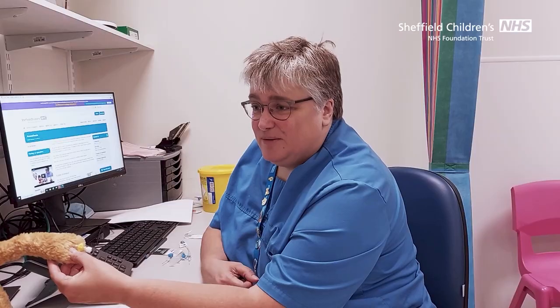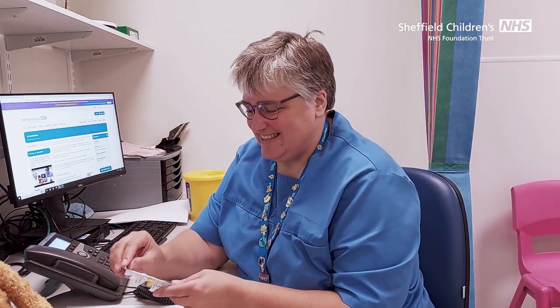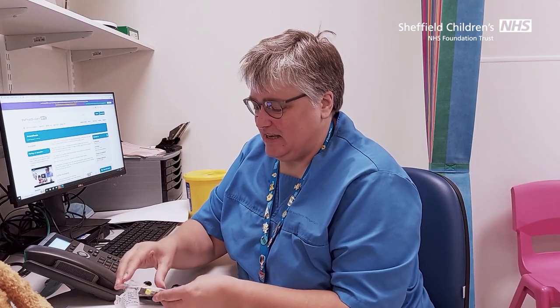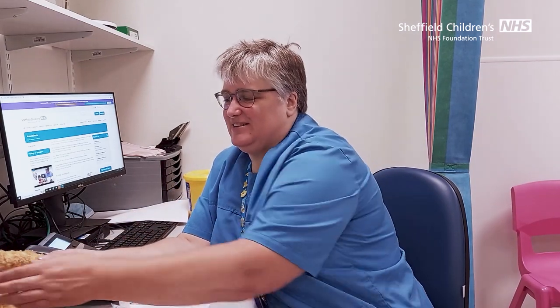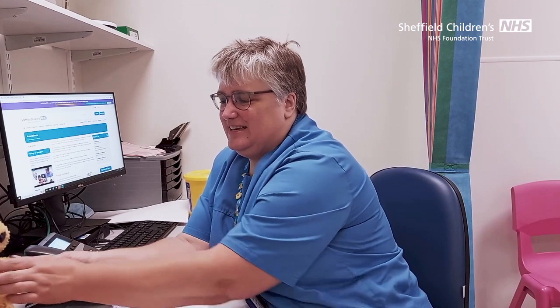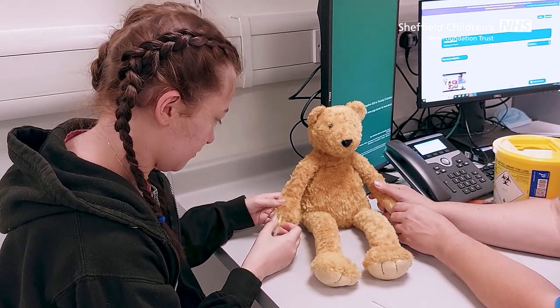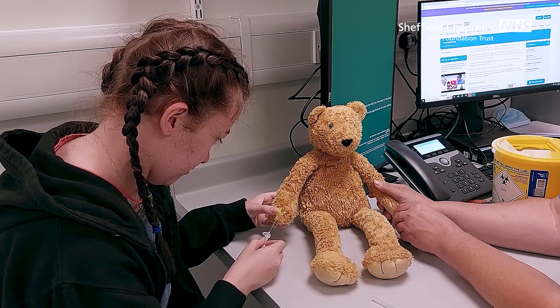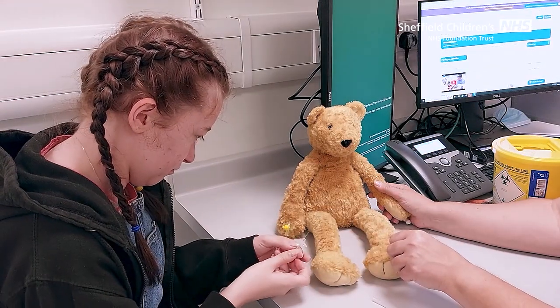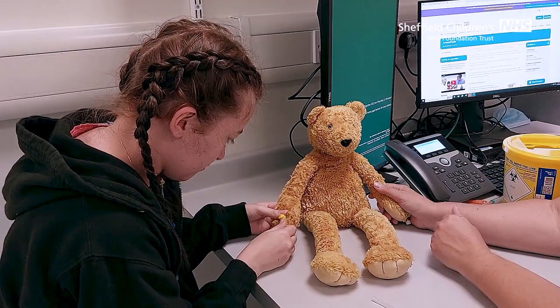And that's him done. Would you like to have a try at doing that? Yeah. Oh, well done. So, here's another cannula. And perhaps this time it can go in this paw, but I'll hold Aussie's paw on this side so that he feels comfortable and he can look the other way. That's right, just take this bit off here. Now hold his paw tightly, put the cannula in there. That's right. And then pull the needle out. Well done. You'll need to save the little white bit from the end, and then the needle can go safely in the bin. Job done. Well done.